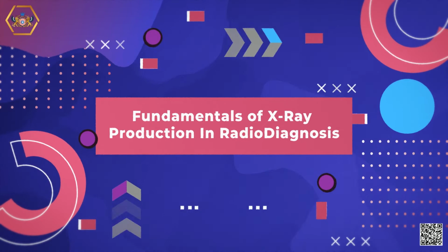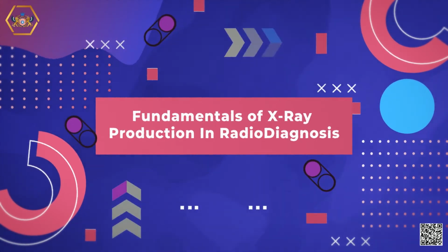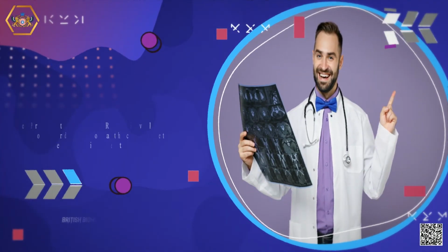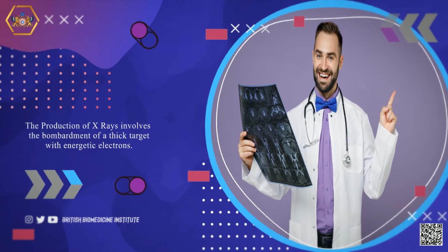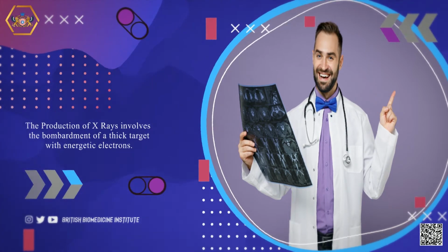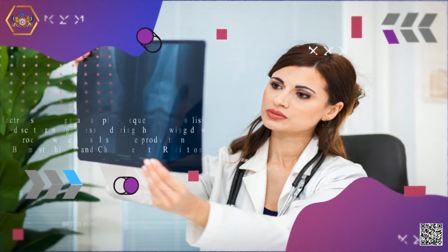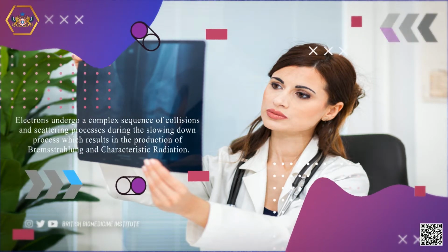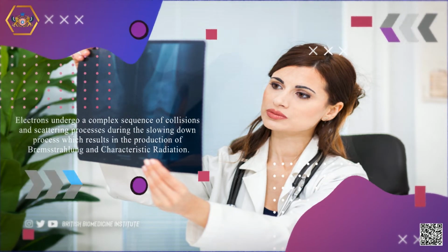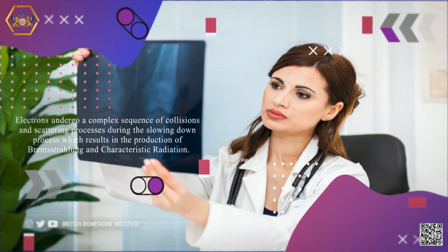Today we will explore the fundamentals of X-ray production in radiodiagnosis. The production of X-rays involves the bombardment of a thick target with energetic electrons. Electrons undergo a complex sequence of collisions and scattering processes during the slowing down process, which results in the production of Bremsstrahlung and characteristic radiation.